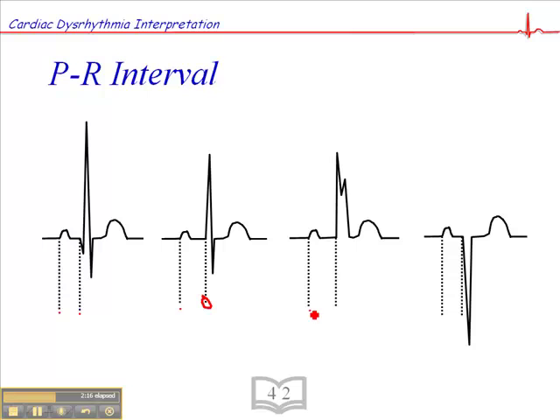Here we don't have a Q wave but we have a QS-type QRS, so we're measuring at the beginning of that QRS. And here we have no R wave but just simply a Q wave alone, so again we measure the beginning of the P wave to the onset of the QRS complex.